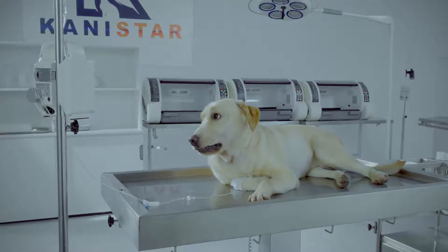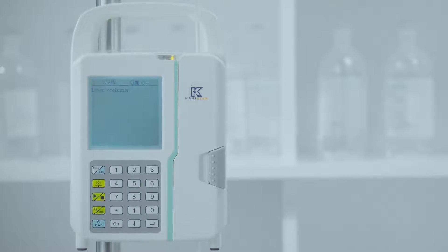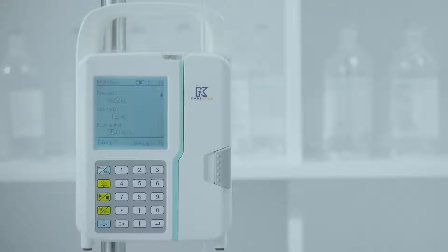Obstructions and blockages will be detected and an alarm will be triggered. Once the blockage is removed, the downstream transfusion will be restored and the alarm will be cancelled.